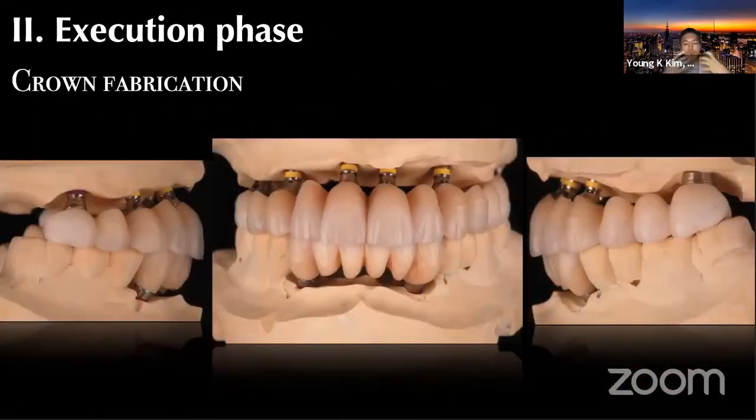So when we receive the cases, we check the occlusion, as I said, with shim stock, and then we always re-verify the extraoral information before seeing the patient. I personally shim stock every single tooth on the articulator, verifying the bite before even booking my patient chair. And I prefer, as I said, to cross mount myself with my articulators, so the lab technicians have the precise starting information and reference to start with.